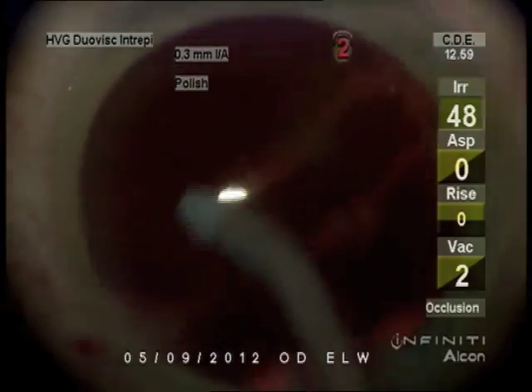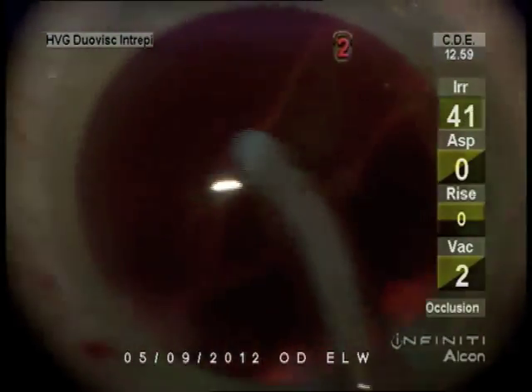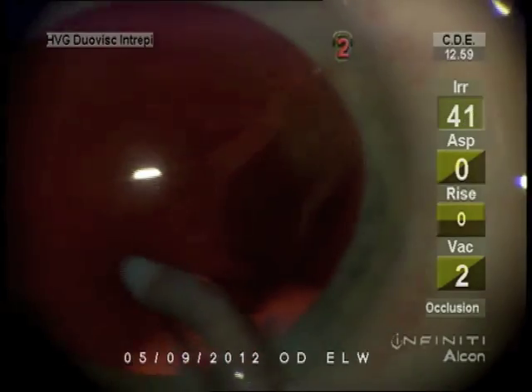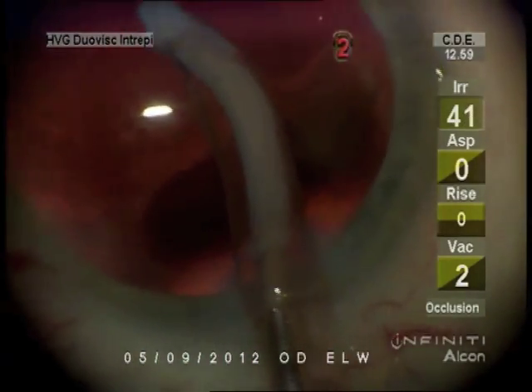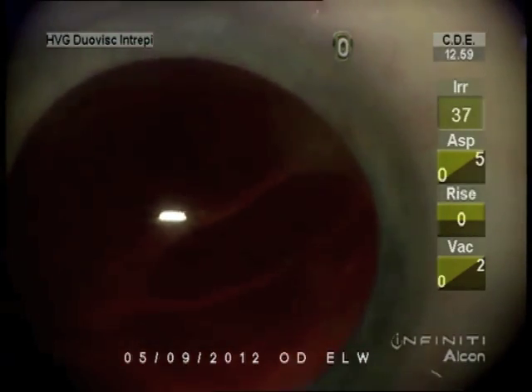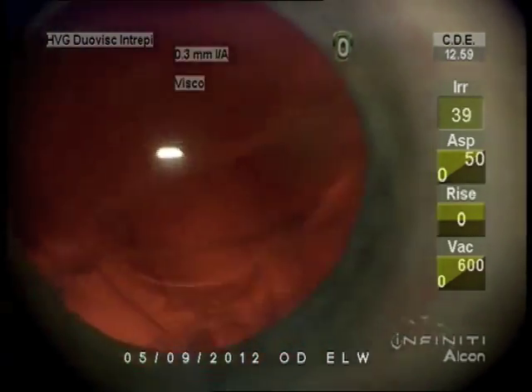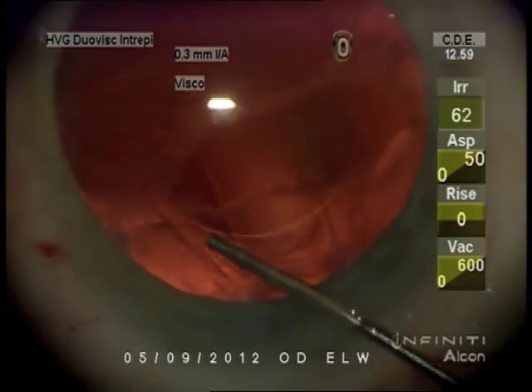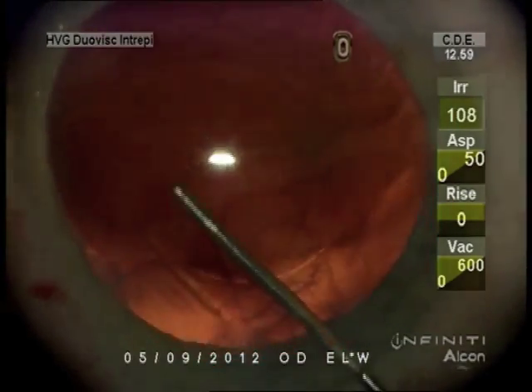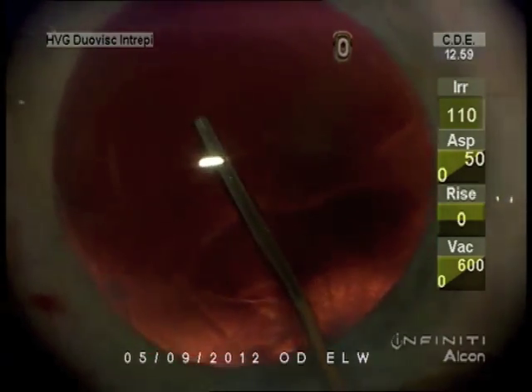Polish mode is just a couple of millimeters of vacuum, so it's quite safe with this silicone tip. And we have it programmed so that the bottle height goes down as well during that part of the treatment, so it makes the posterior capsule flat. Notice how it went in here tangentially.